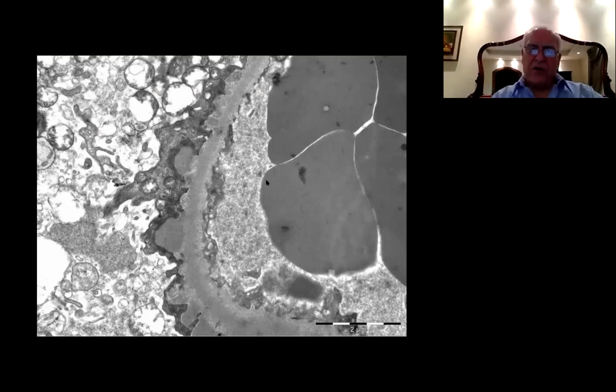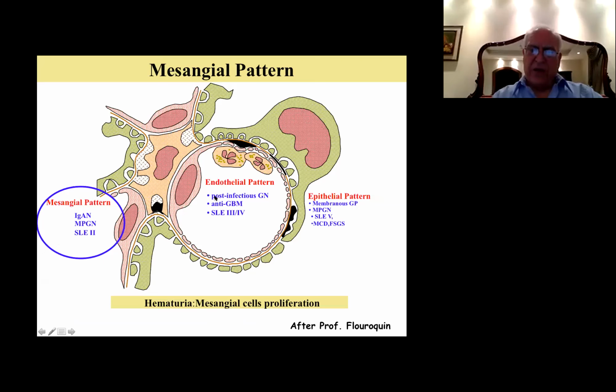Let's move on to the endothelial pattern of injury, where you have the endothelium, it's being active. There is some call for exudation. Why really does it cause inflammation? Because this is in proximity of the bloodstream. Here the bloodstream and the components are away from this, so there is no chance for activation of the complement system. But here you have your immune complexes in contact with the blood, so basically it will enhance the formation of inflammatory cytokines and exudation will occur.